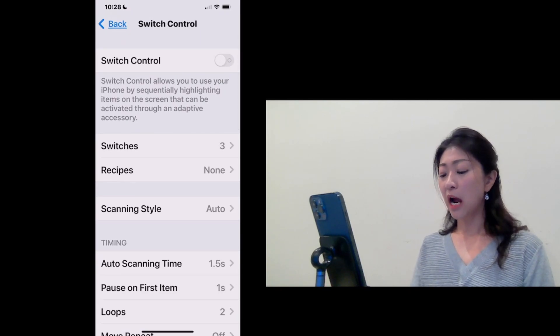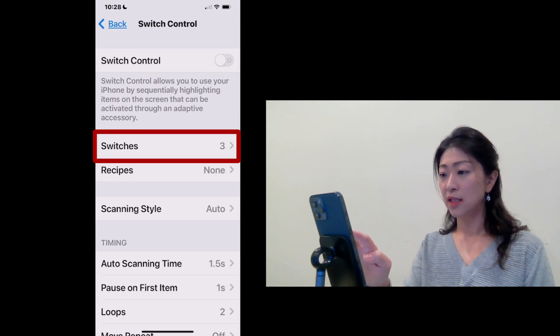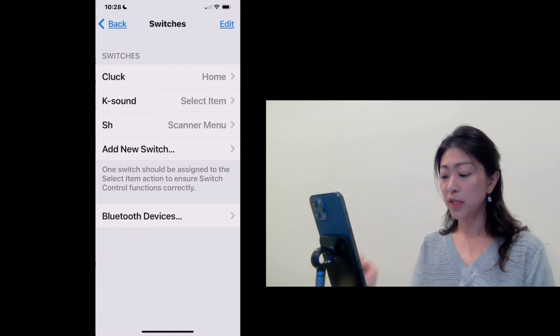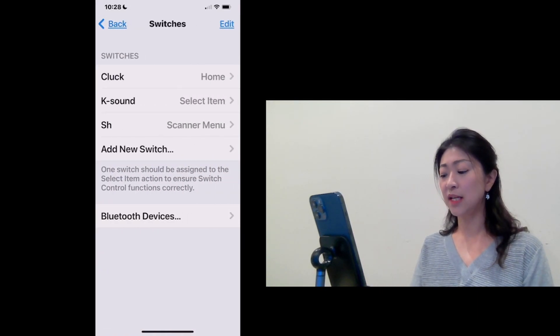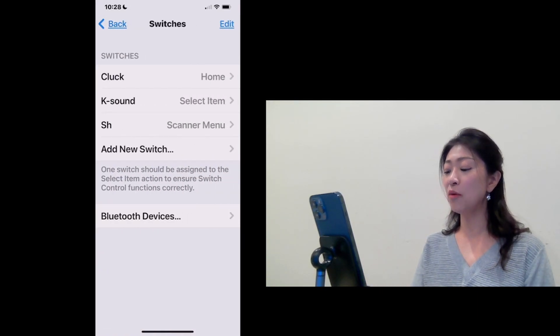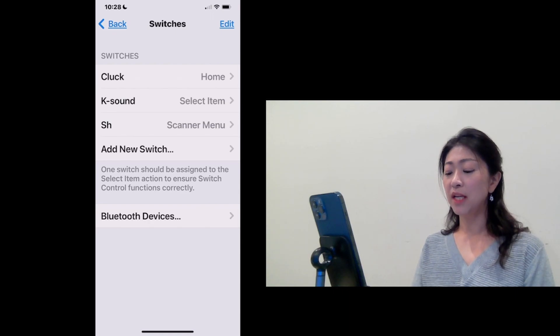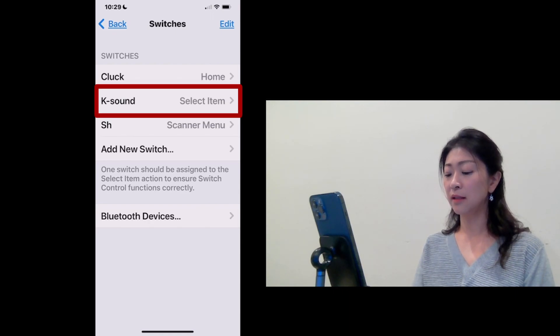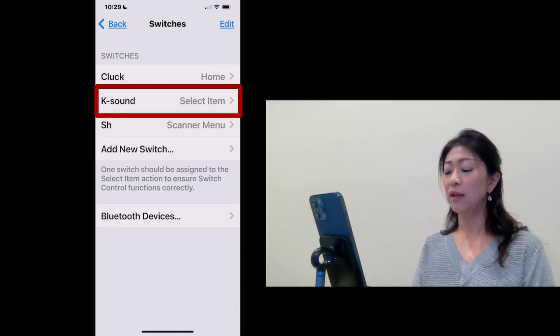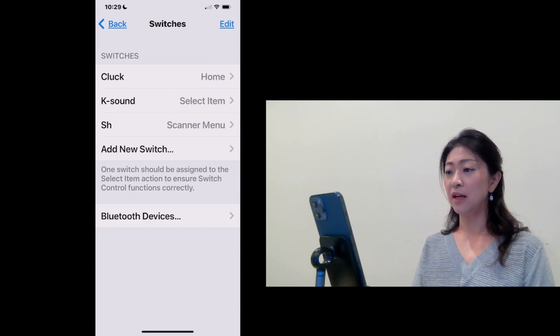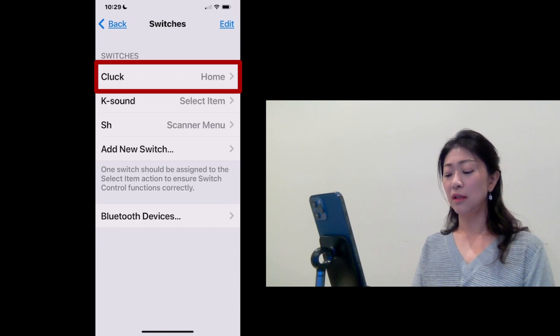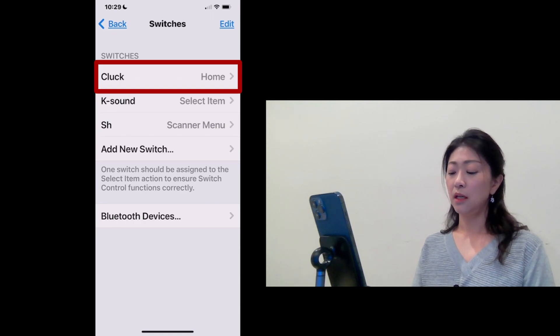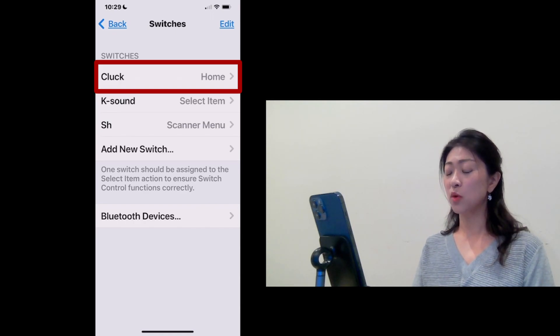Here, I want to point out that if you look under Switches, I've previously set up a few sound switches. So when I make K sound, it will select item. And if I make cluck sound, it will take you to the home screen.